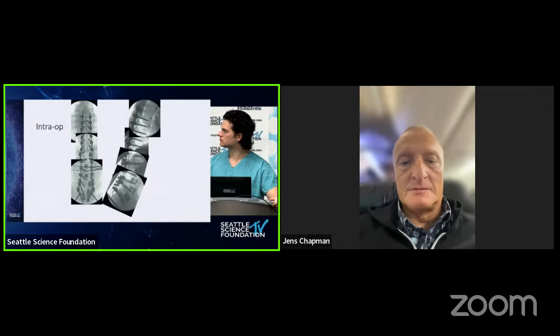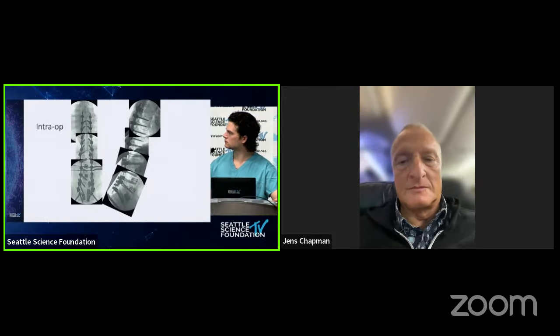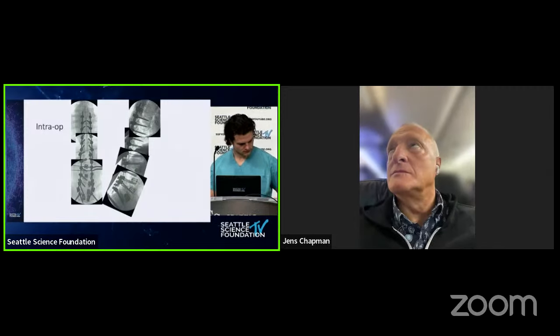Yeah, I mean, I think L5 is always tricky, and you can have normal neuromonitoring and still end up with a foot drop. So, excellent. Thank you, David. Thank you.